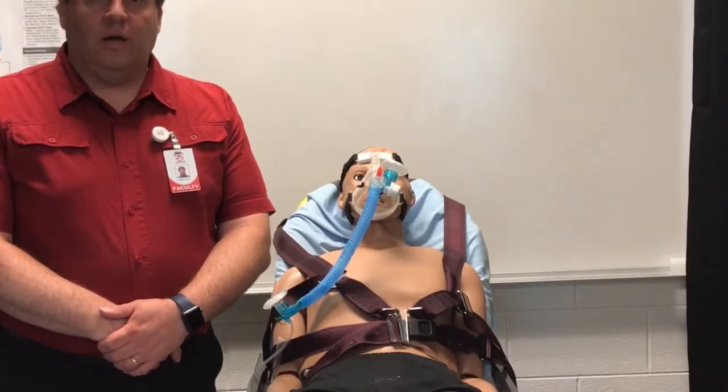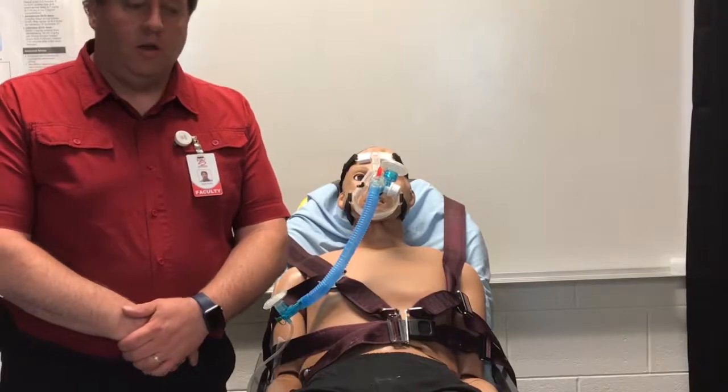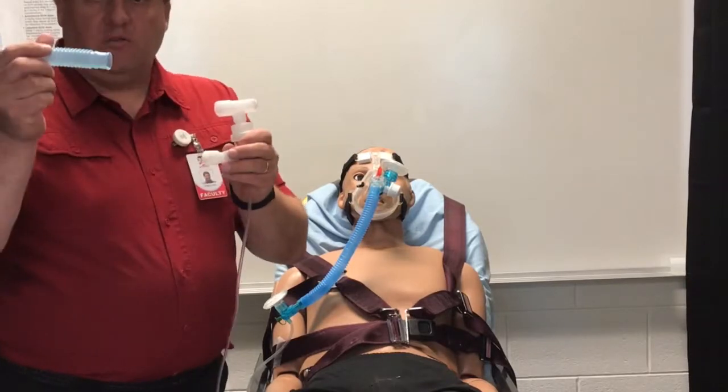I had a few of you in class ask about attaching a nebulizer to a CPAP, and we can definitely do that. You would set up your nebulizer as you normally would, add your medicine, but you will not need the mouthpiece or the exhalation tubing.